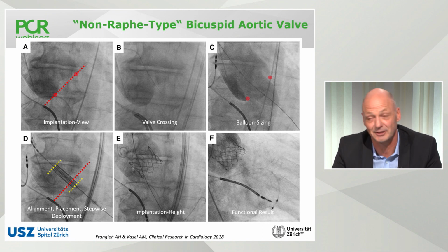That makes no sense, and we know it by CT. So you've mentioned the AL1 and the AL2, but I think sometimes you use a different selection of catheters, particularly for horizontal aortas. Yeah, we also start with AL1 and then switch to AL2, especially in large anatomies. But especially in horizontal aortic routes, we have made the experience that using the EBU or XB catheter could be quite useful. The curve, coronary guide catheter.